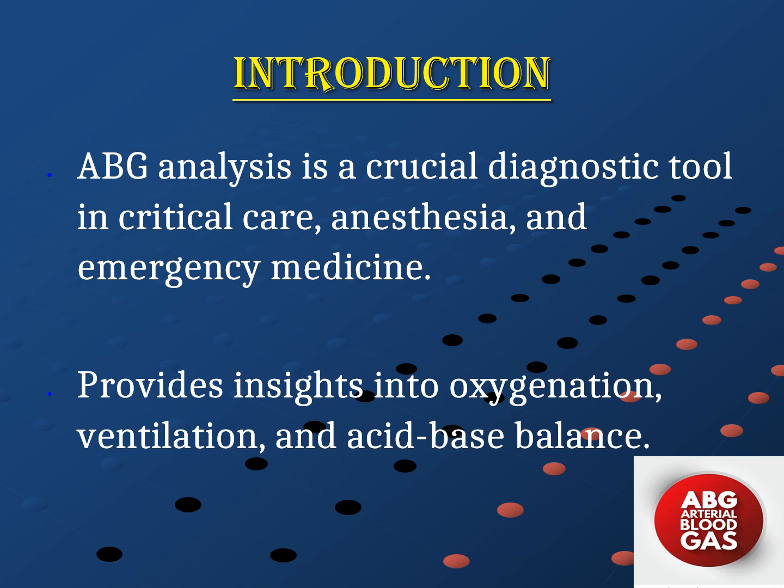ABG analysis is a crucial diagnostic tool in critical care, anesthesia, and emergency medicine. It provides insights into oxygenation, ventilation, and acid-base balance. ABG analysis is crucial because it checks oxygen levels, carbon dioxide levels, and acid levels. This helps doctors make informed decisions, diagnose conditions, and monitor treatment. ABG analysis helps doctors understand how well a patient is breathing and if their body is working properly.